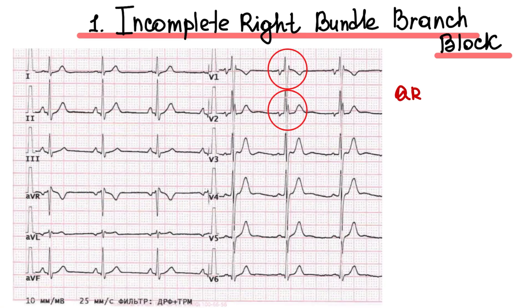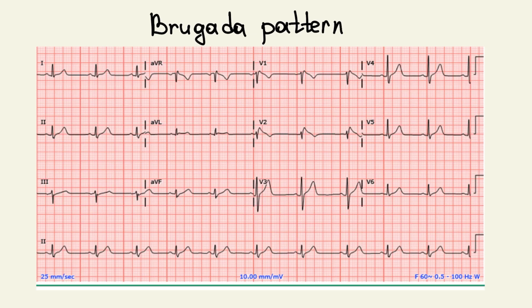QRS duration is less than 0.12 seconds. We can see an RSR pattern in leads V1, V2, and sometimes V3. It's typical for young people and athletes. We always need to differentiate right bundle branch block with Brugada pattern on ECG.